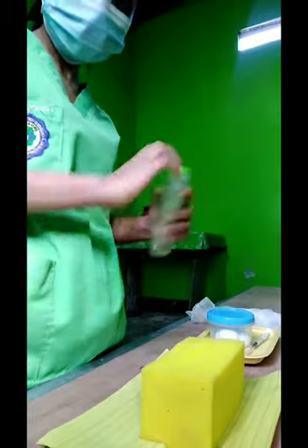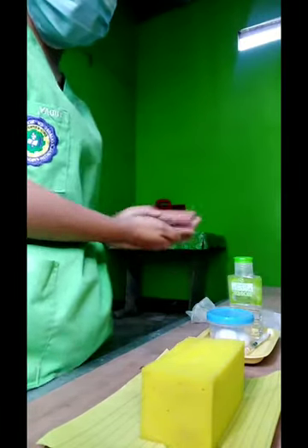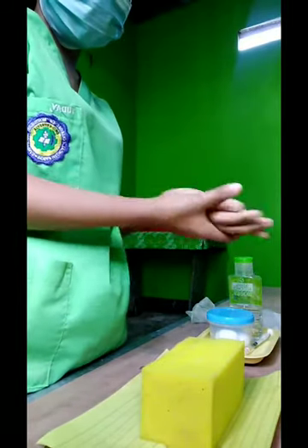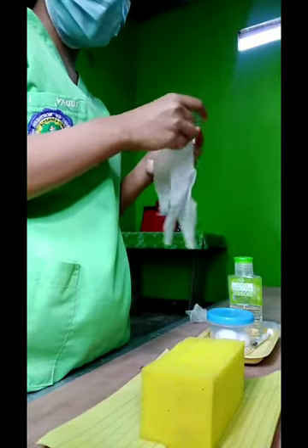Then, perform hand hygiene. Put on gloves.